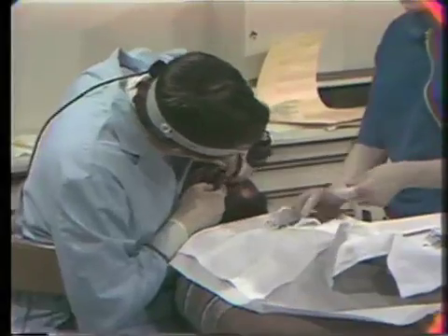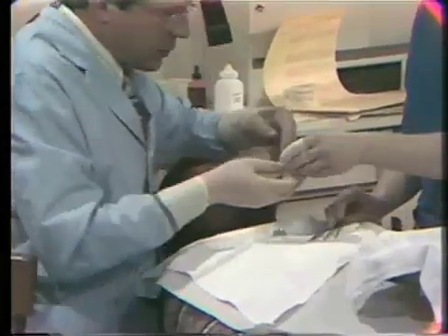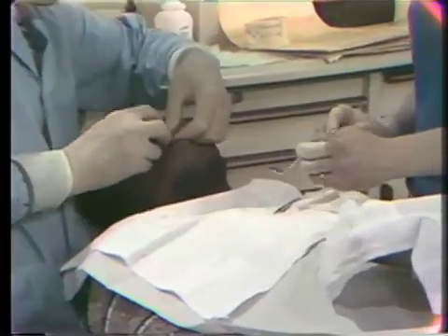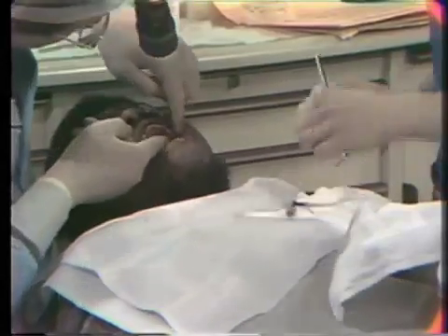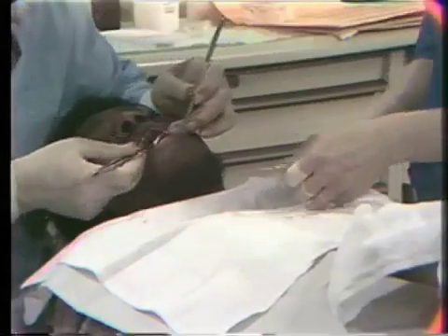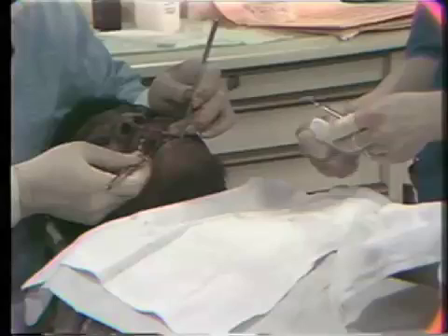Now here's where I overguessed a little bit. She did an excellent job of mixing that material, but I overguessed, so we're going to have a little excess left over. But that's no problem. It's pinched off and dropped. And as I'm pressing it now around the surgerized area, I place it right at the margin, a little bit apical to the margin of the flap, so that when I press it, I'm pressing the flap in against the teeth. And notice how she handed me a mirror and cotton pliers.